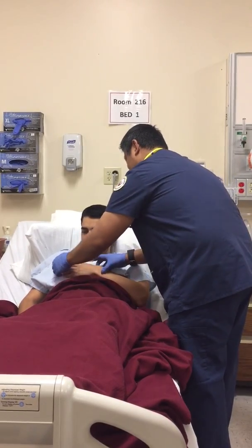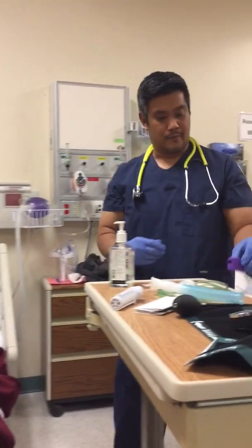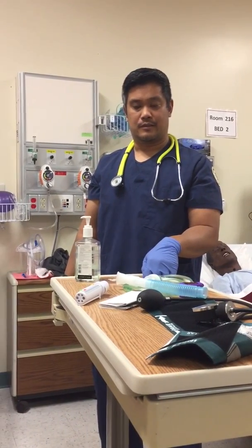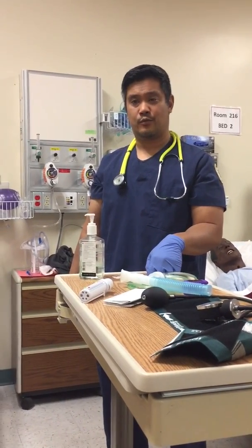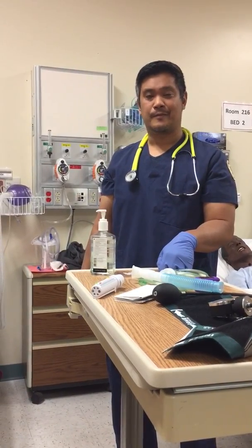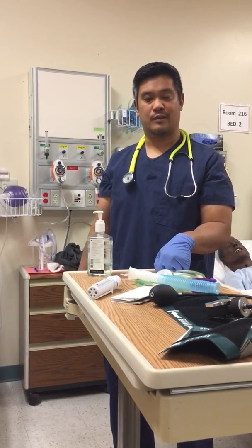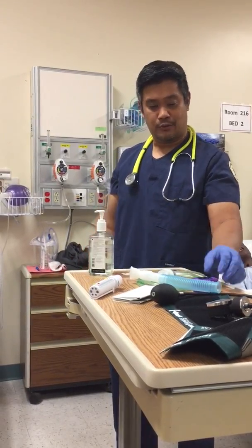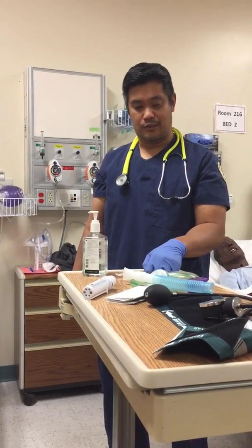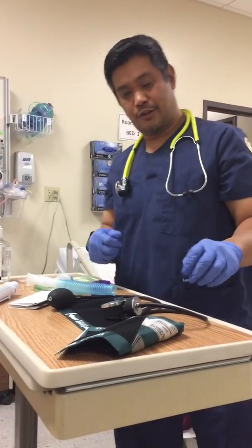Alright, thank you, Christian. Go ahead and take this from me. So I counted his heart rate for 30 seconds, and I got 45. Multiplied by 2, got 90. Also counted his respiratory rate at 8. Again, multiplied by 2, I got 16. His pulse ox reading shows at 97, which is all in the normal range. And let's go ahead and do the blood pressure.